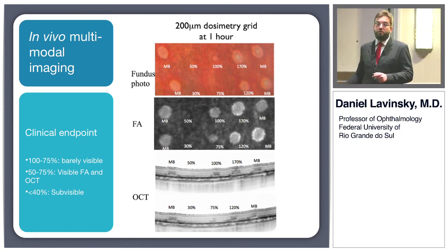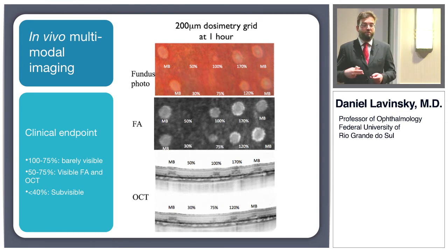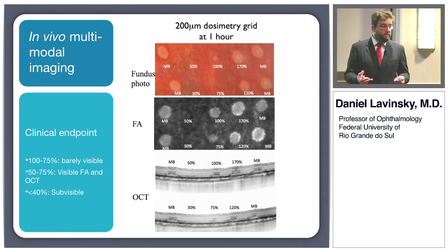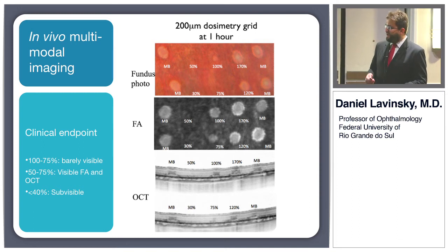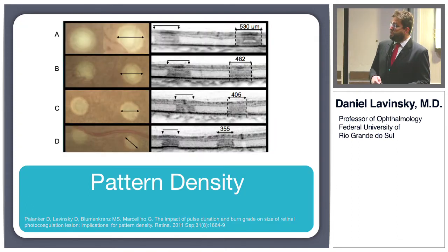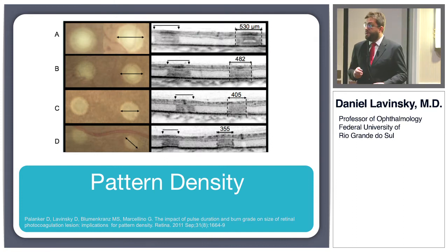So we don't know that if we go below that, we are doing anything other than biochemical stimulation of genes. So it's important to adjust the pattern density.